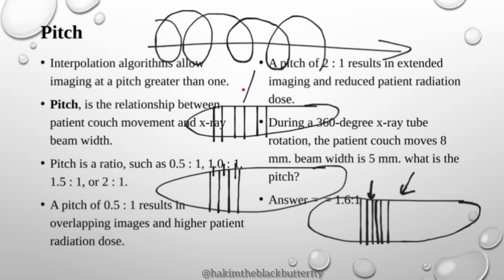So with this one, you can scan a very big length or a very big volume of the anatomy in the shortest time possible. This one, skin to skin, is not the very shortest time, but it is also important.